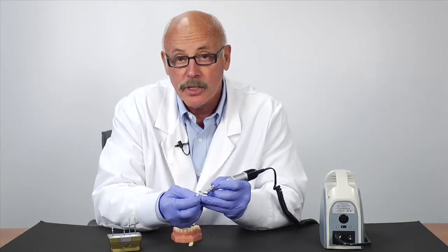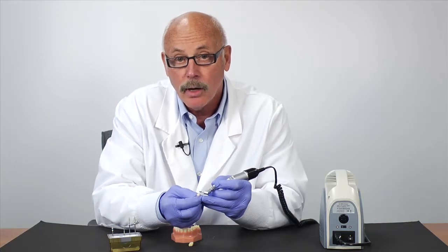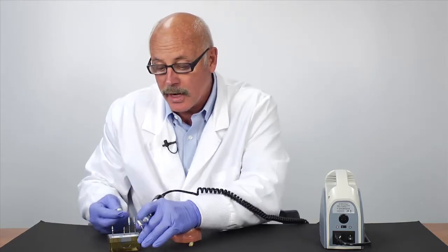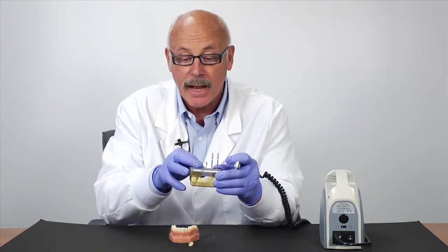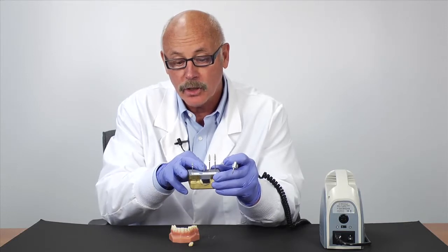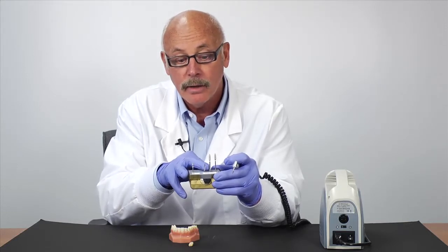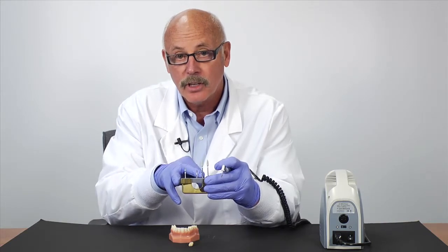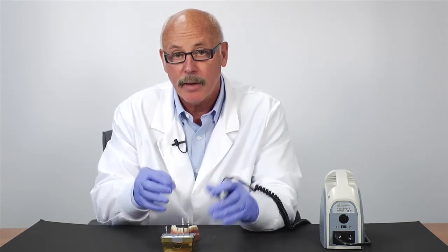Whether you're adjusting tooth structure or porcelain, Sara Master and Sara Master Coarse are easy to identify — Sara Master Coarse has no band, and Sara Master has a white band. Try Sara Master; the results are dynamic.